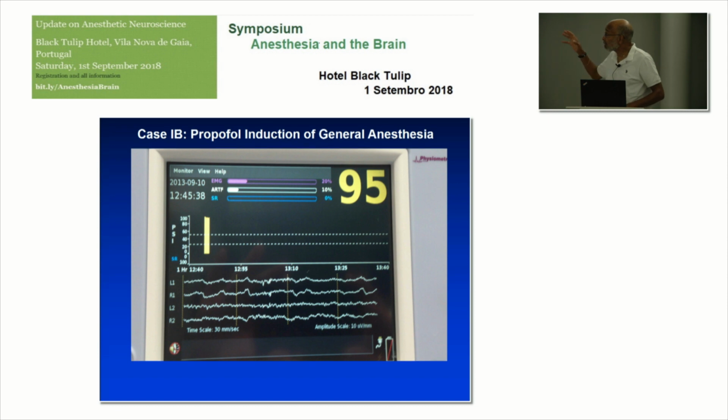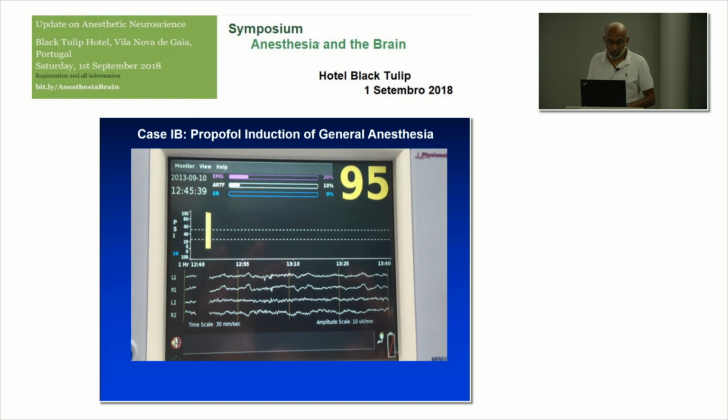It's been about 5 years now. And she's going to have thyroid surgery, and we're going to give her a bolus of Propofol. And we're just going to watch the EEG changes that transpire as she becomes unconscious, all right? And I'm just going to talk you through this, all right?